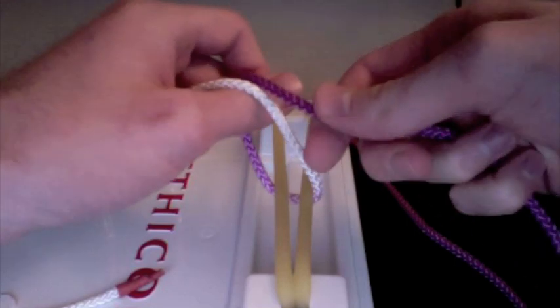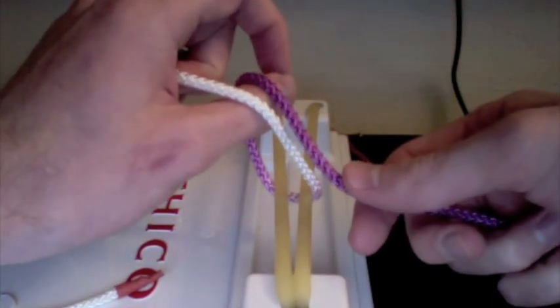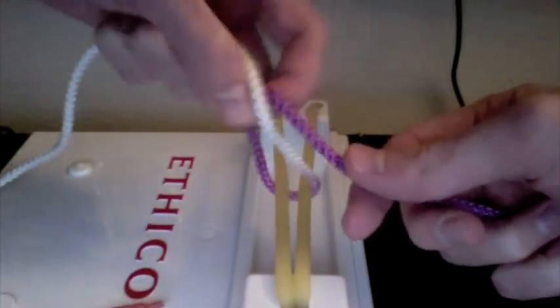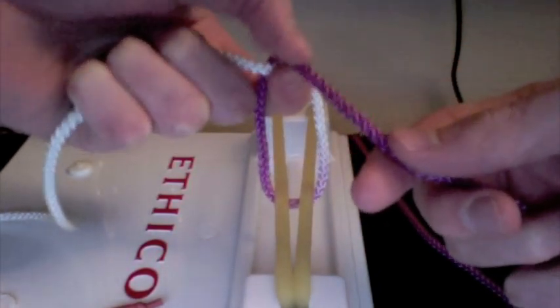Then you're going to make a little bird beak on the other side. The bird's going to come through the hole — you're just rotating your hand. You're not letting go of these two fingers; they're always attached here. You see how I just rotate that through.